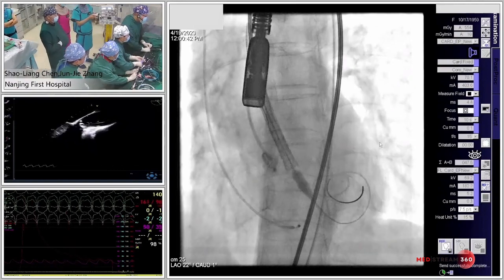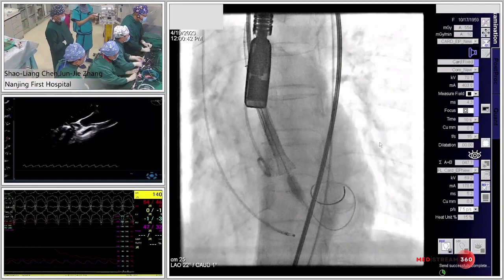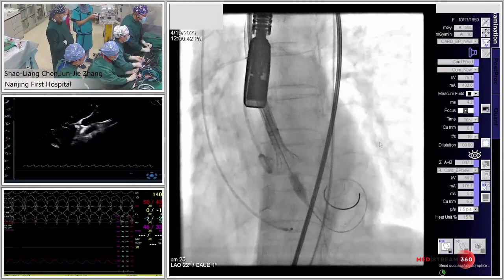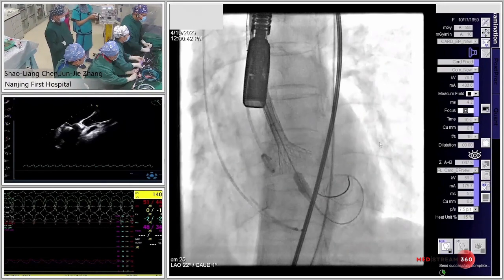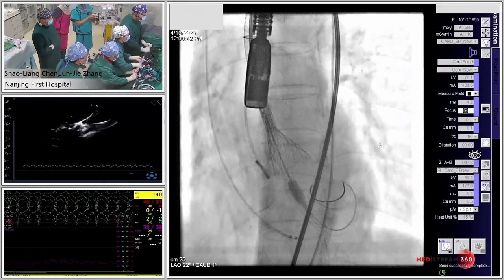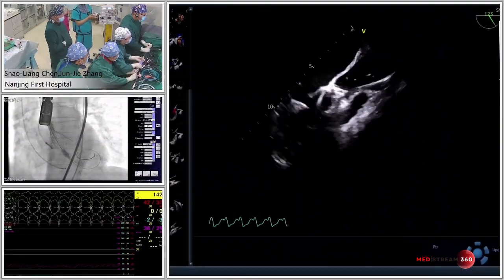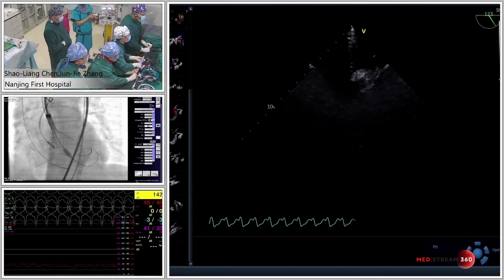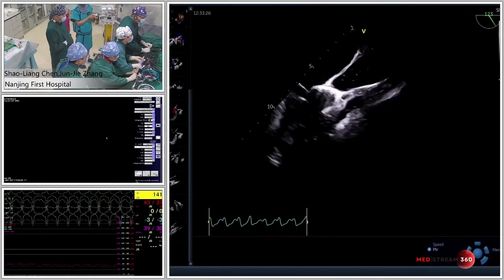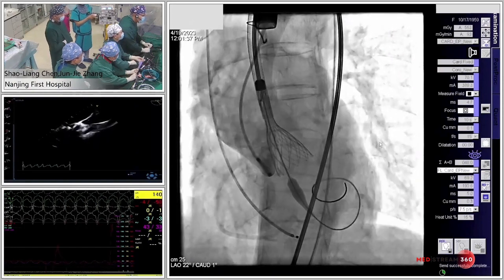So now I feel the protrusion is greater than 5 millimeters. Yeah, less than, yeah. Okay, about 2/3 of the valve. Good. Yeah. Good. Release. You still can retrieve. Release to the critical point? I think the position is good.